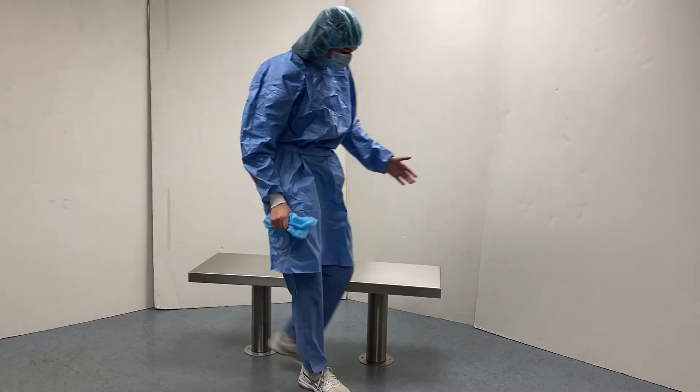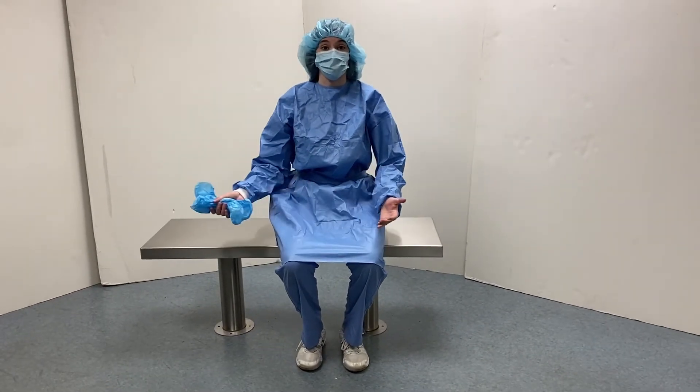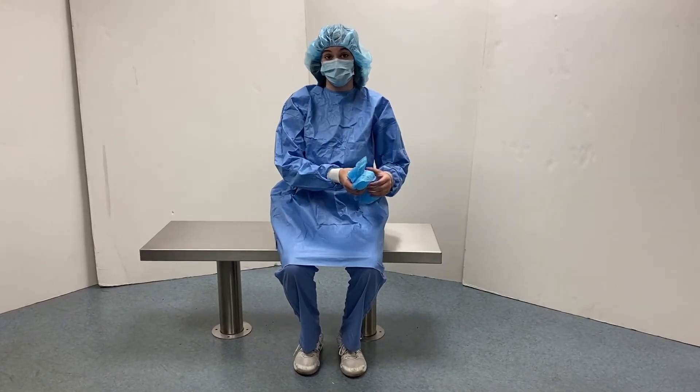Additionally, the bench is positioned at a great height that makes it easy to sit comfortably or allow someone to help you get any PPE on before surgery.